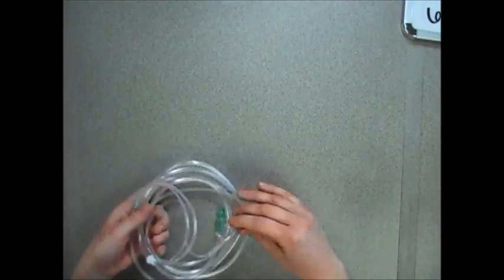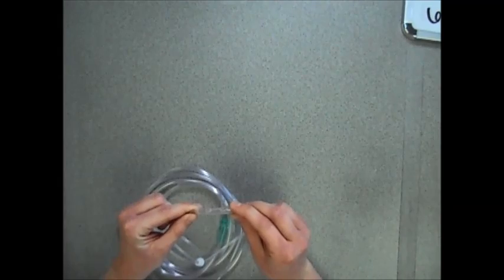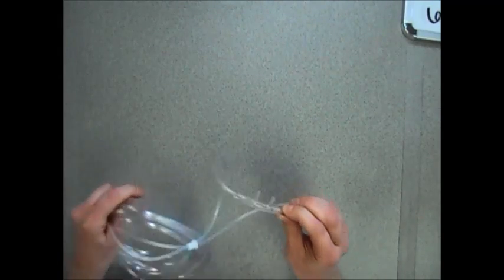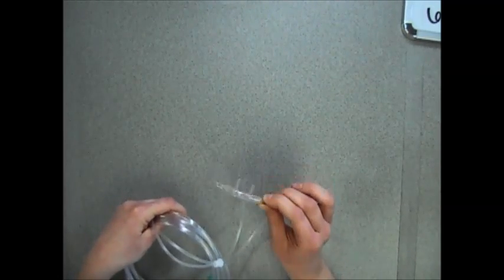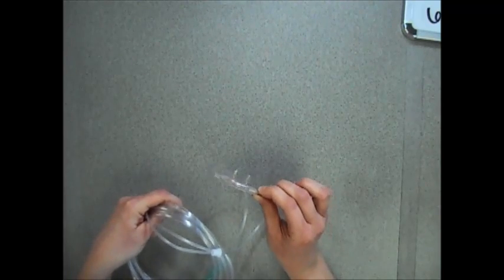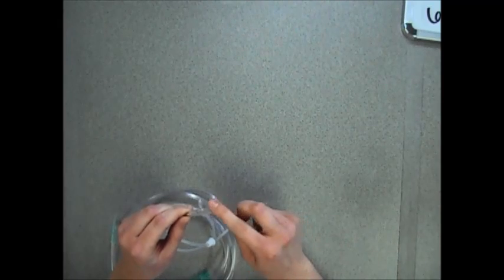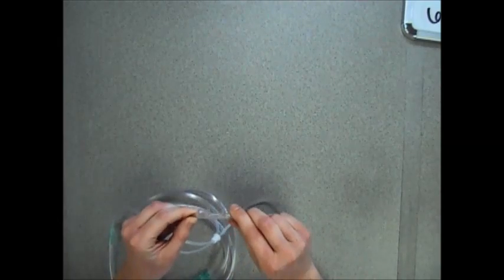With the nasal cannula device, you will see that there are 2 plastic prongs that allow oxygen to flow from the cannula into the nares. Before applying the nasal cannula to the patient, you always want to make sure that the oxygen supply has been turned on and is flowing through the oxygen device. As you apply the nasal cannula to the patient, be sure that these prongs here tilt backwards towards the patient.